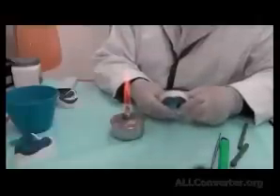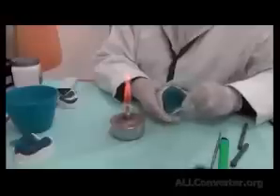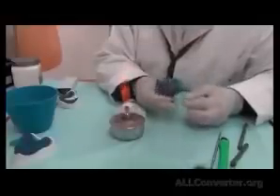This will mimic the patient while he's whistling or blowing. The lip comes lower, and the sulcus itself comes shallower than the resting stage. So this is what we're recording. Once more, it's the functional depth and width of the sulcus. At function, of course, not at rest. So, once more, we have border molded the material, and the excess went to the outside.